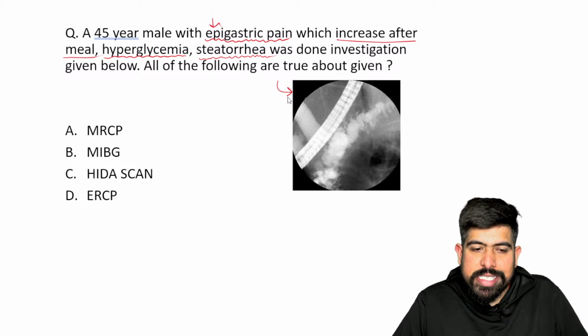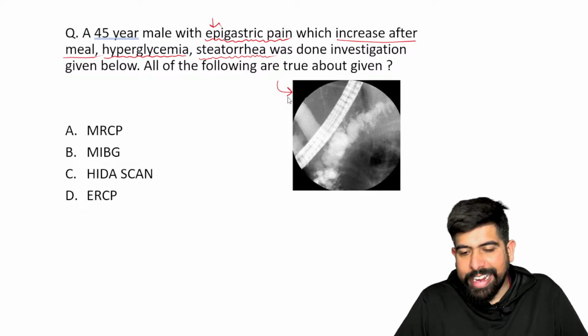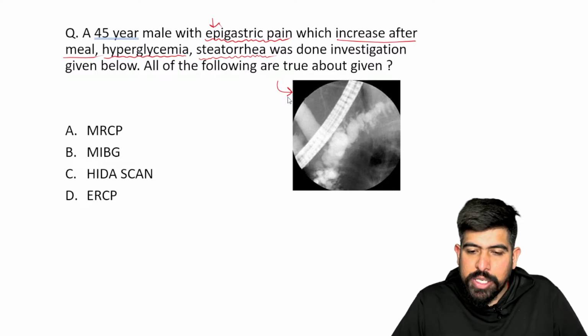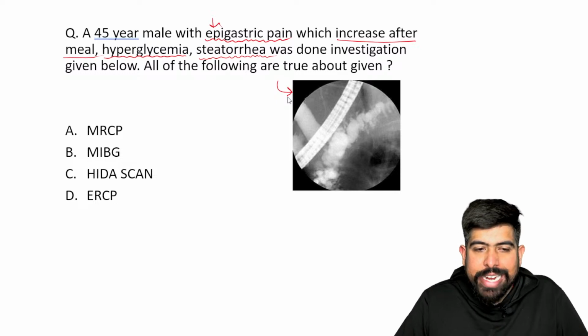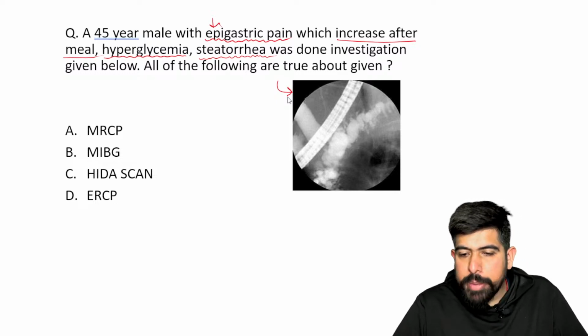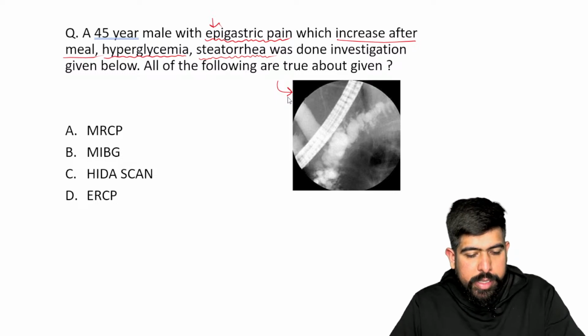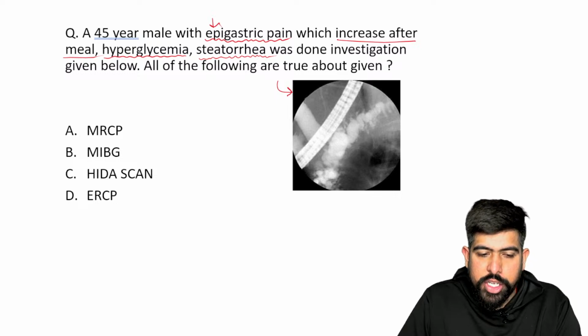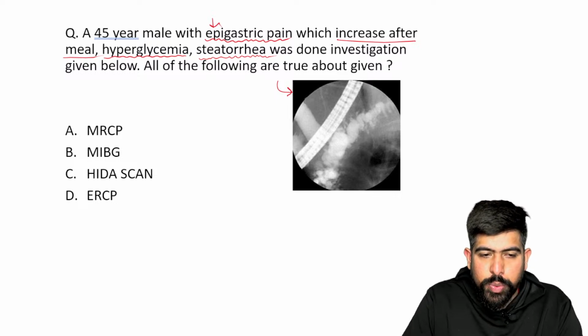We are seeing the tube. What will be the diagnosis, guys, in this case? Okay, I agree with you. You all are replying the option is ERCP, sir. Option D is there. Can anyone of you diagnose this? What is this patient's diagnosis? Then we are done with the ERCP. In which case do we do this ERCP? Can anyone reply in the chat box what your diagnosis of this patient is?